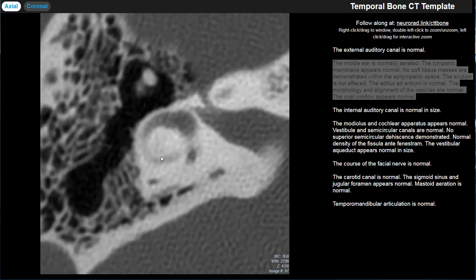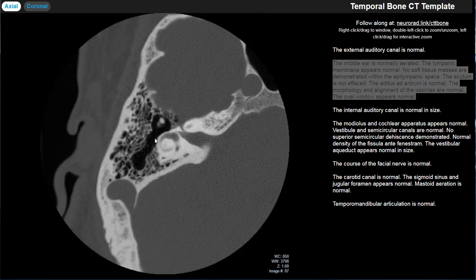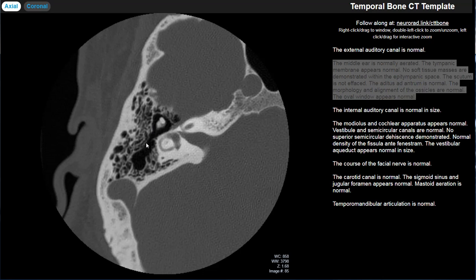The aditus ad antrum is the entry to the attic or the entry to the mastoid air cells. Here we have the epitympanum, then the aditus ad antrum, and then the central mastoid tract or mastoid antrum — the largest portion of the mastoid air cells. If the aditus ad antrum becomes occluded by a soft tissue mass or mucosal thickening, it can lead to fluid buildup within the mastoid air cells and potential superinfection — analogous to sinus drainage pathways in the paranasal sinuses.